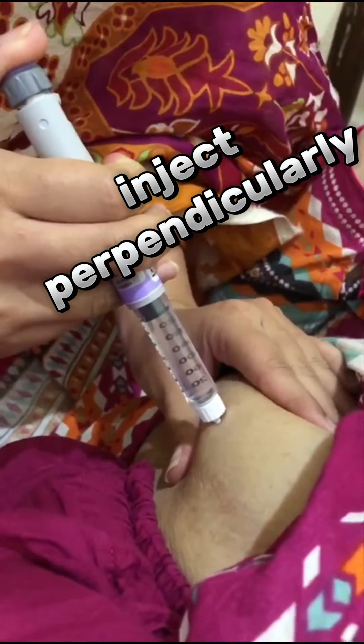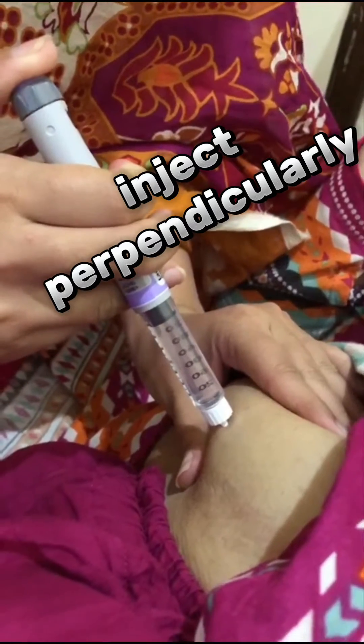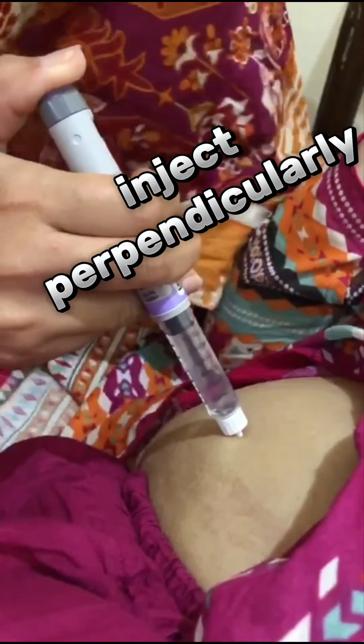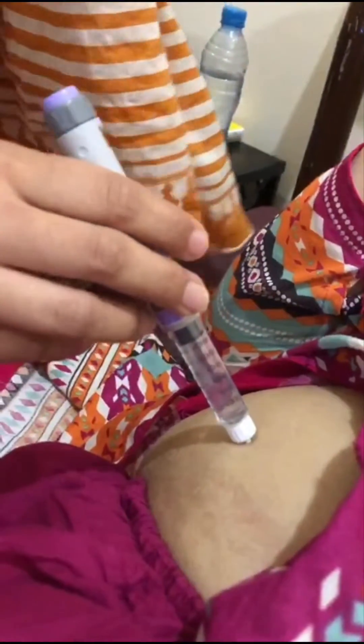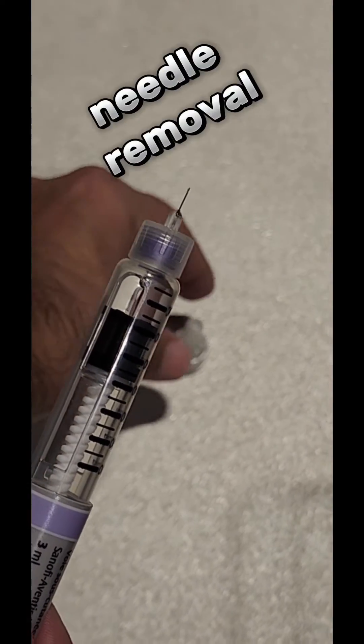Press at the back of the dial and the dial will reverse back to point zero, suggesting that the insulin dose has gone in. Wait for 5 to 10 seconds before removal of the pen device.